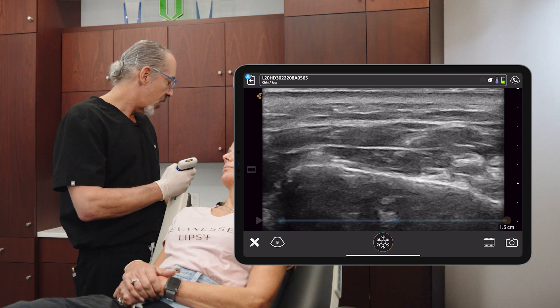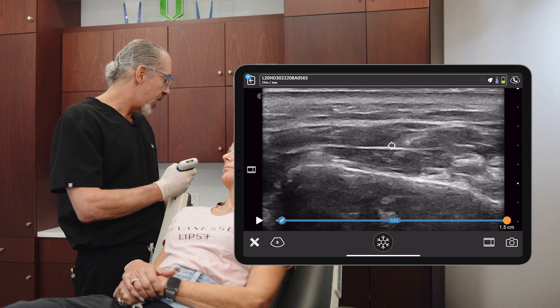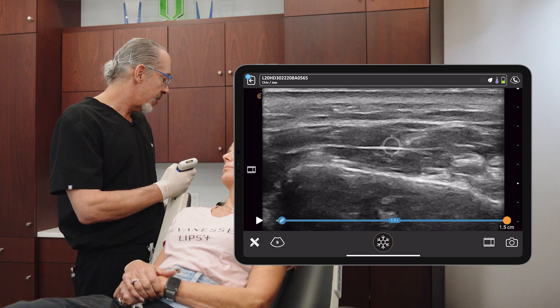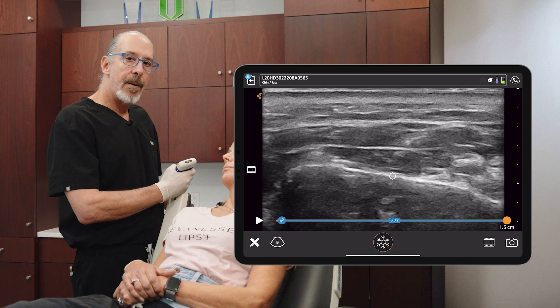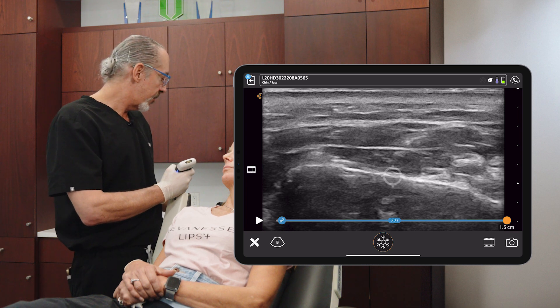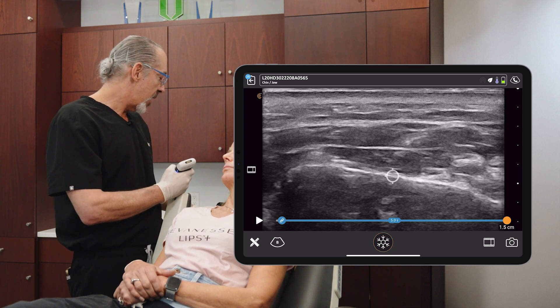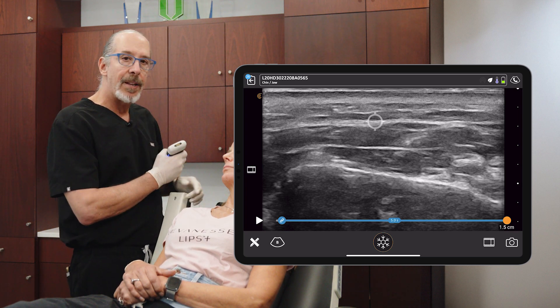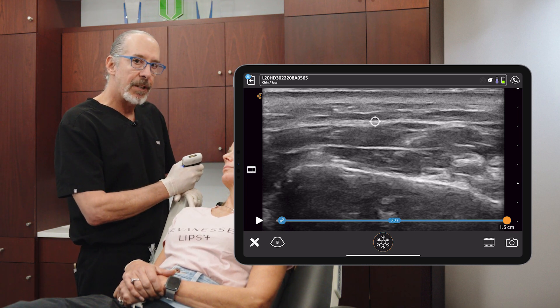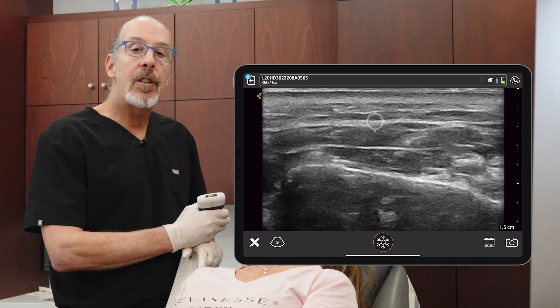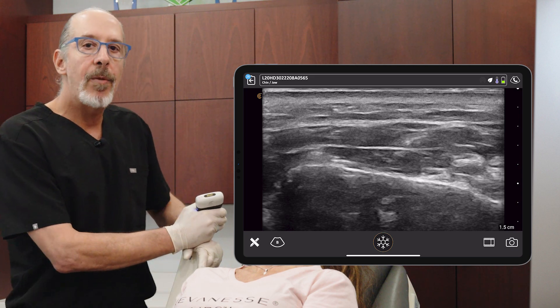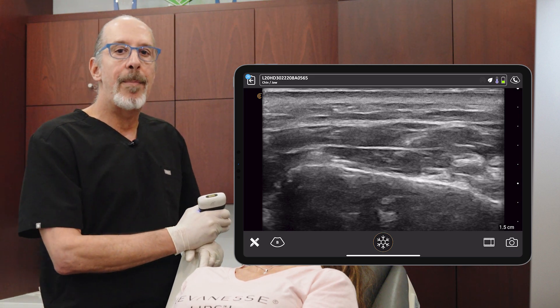So right here is that deep inferior tendon. Here is the mandible. And here is the parotidomasseteric fascia. So that concludes the evaluation of the masseter.